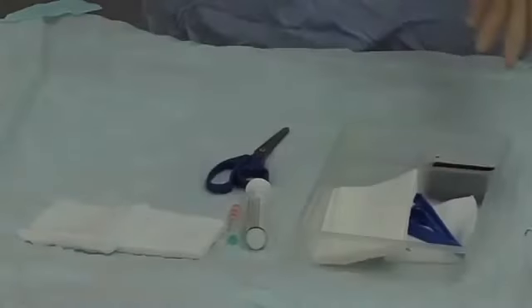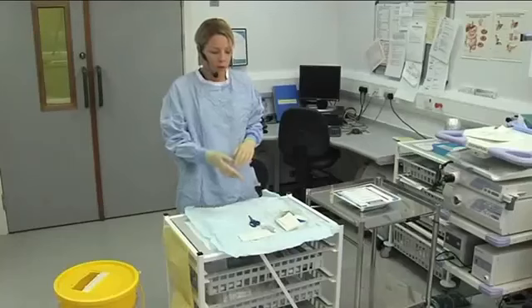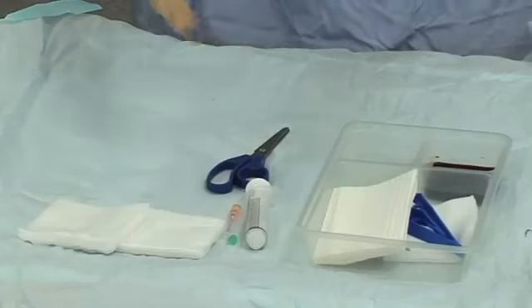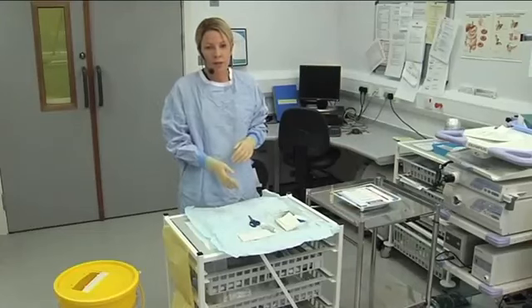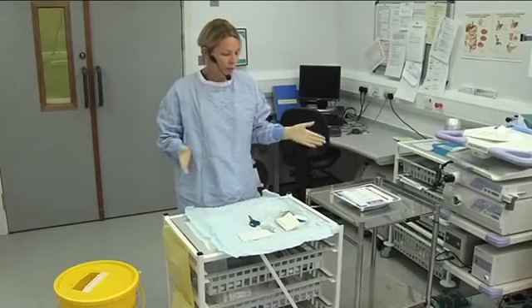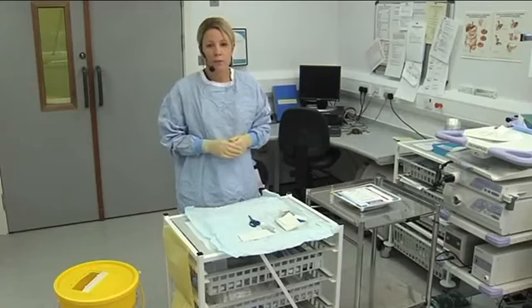As you can see, we have some betadine and some extra sterile gauze. We have a 10 ml syringe which we're going to inject our long-acting anaesthetic with, a drawing up needle and an injection needle to actually put it within the abdomen. We also have some scissors so we can cut the tube after the procedure, and as you can see, we haven't put the PEG tube onto the sterile area yet because we're waiting for the patient to come in and then we'll dispense all the products.